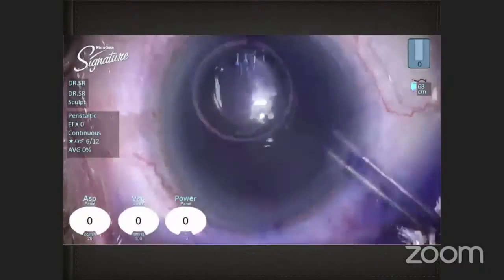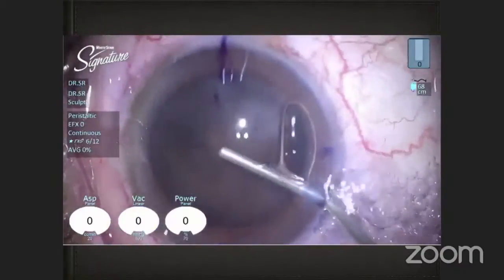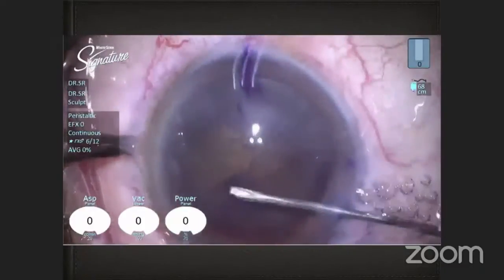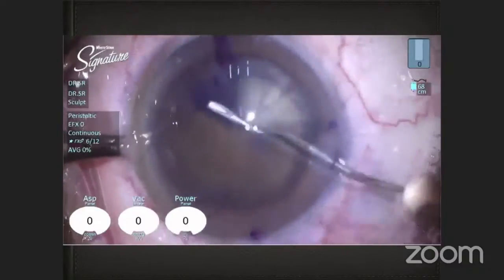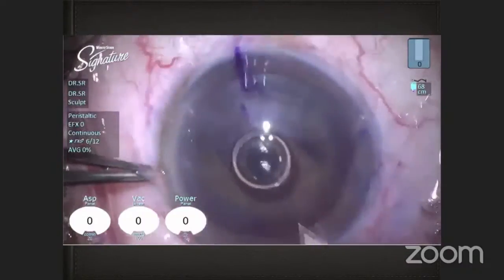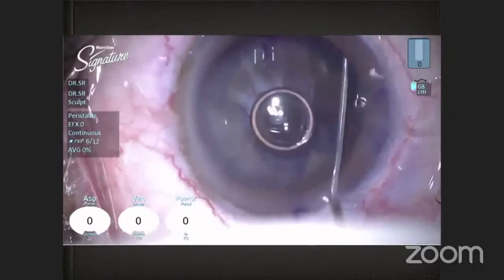Trypan blue is something definitely which we use in these cases, as you don't necessarily have a good red glow. And using a good viscoelastic is always helpful. With regards to the capsulorhexis, I like to make it slightly larger than what I would in my traditional cases, because it helps even if you're not able to chop it wonderfully and you have to extract larger pieces, but at the same time, not too large that you don't have an overlap over the lens.